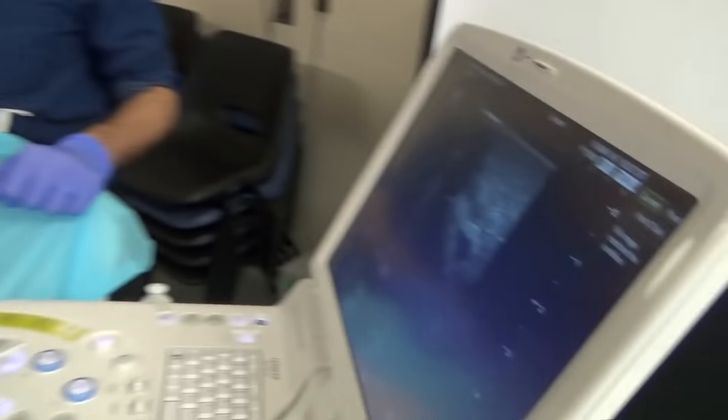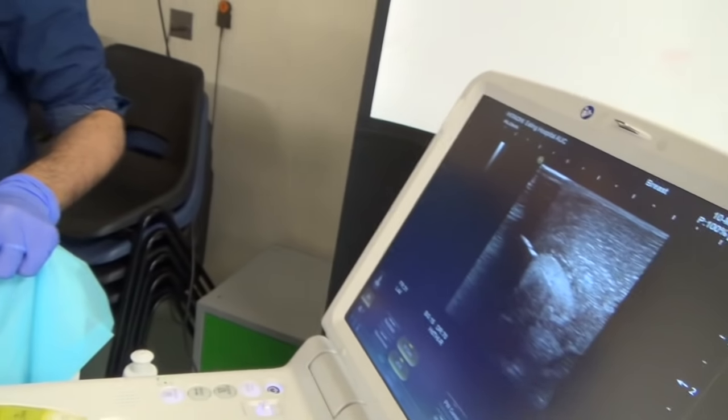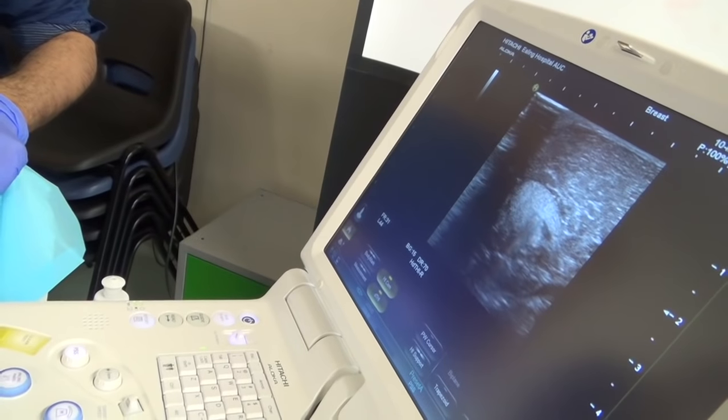You see that needle? There — you can see it. See if you can line up the whole length of the needle.